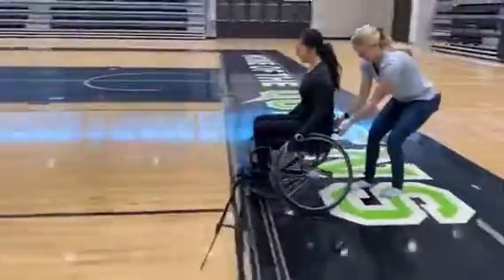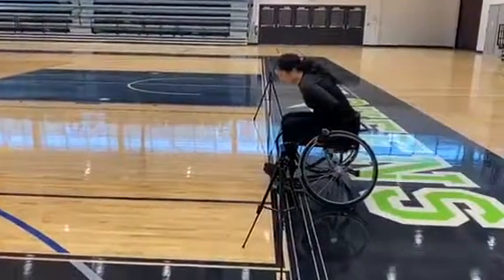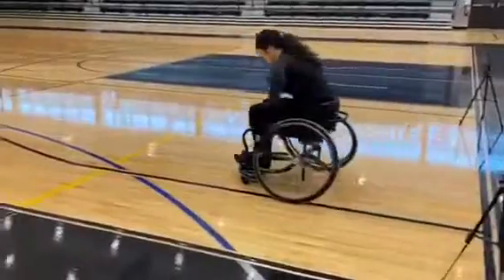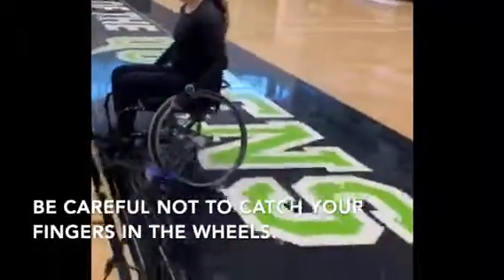For each trial, the administrator will make sure that each participant lines up their wheelchair with the front bar directly behind the green piece of tape. It is important to note that each participant should start slightly leaning forwards to prevent them from tipping backwards. Another important thing to note is to be careful of your hand placement on the wheelchair.